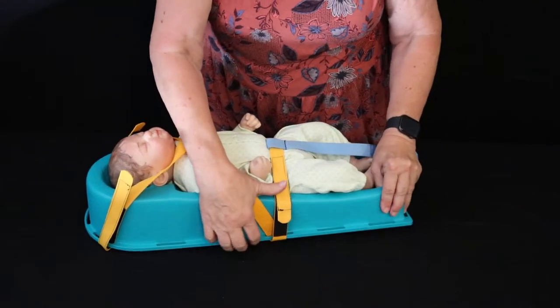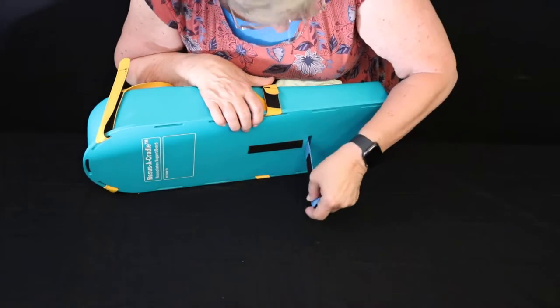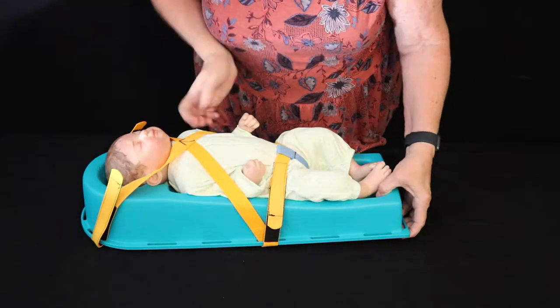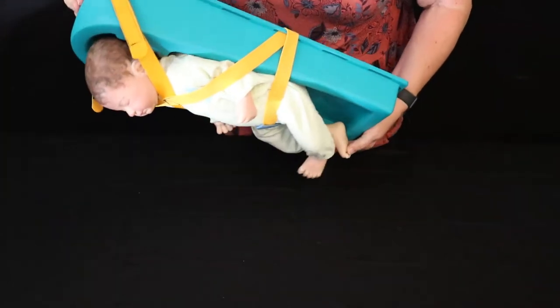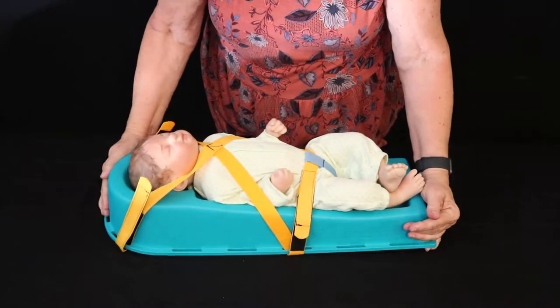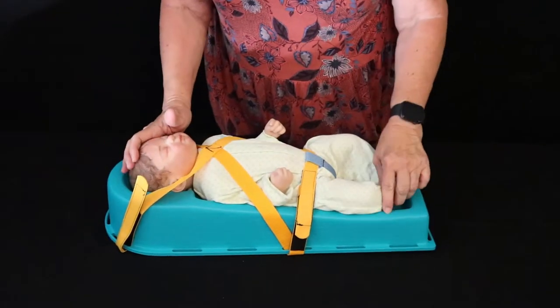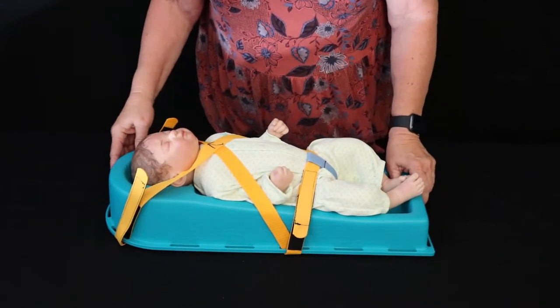With this in place, we can tip the baby and the cradle over, and apply this strap to the Velcro on the back. This actually creates a very secure seating for the baby, and allows you to transport while maintaining an open airway and maintaining safety for the baby in transport.